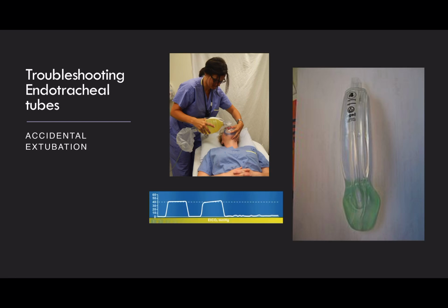The final thing, and probably the thing that most juniors are worried about, is the accidental extubation because you don't have airway skills. And I want to emphasize the fact that you do not need airway skills to be able to manage a patient who has accidentally self-extubated. Now, of course, these patients are at high risk. However, there are simple things that you can do to manage the airway until a senior comes along and re-intubates the patient. The first thing is to know when a patient has had an accidental extubation.